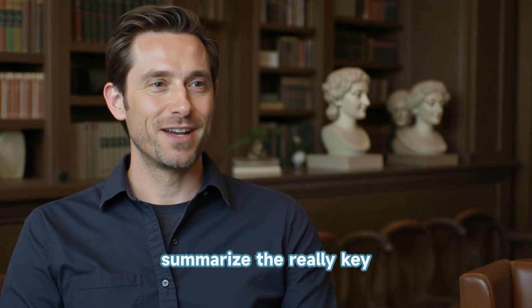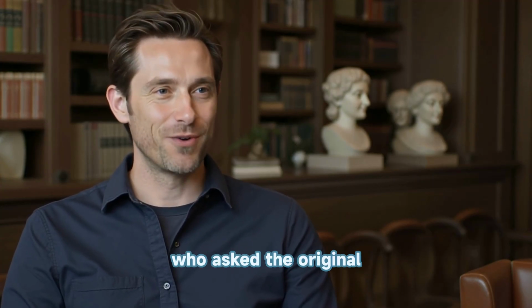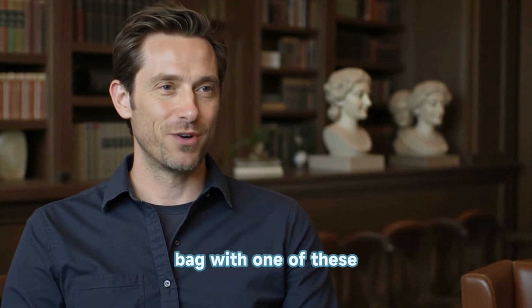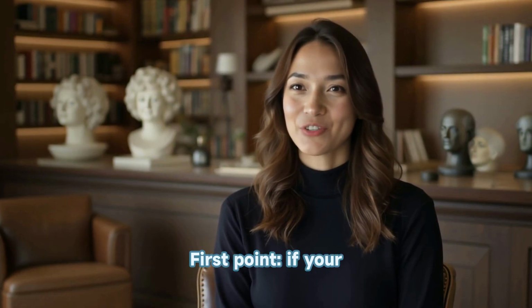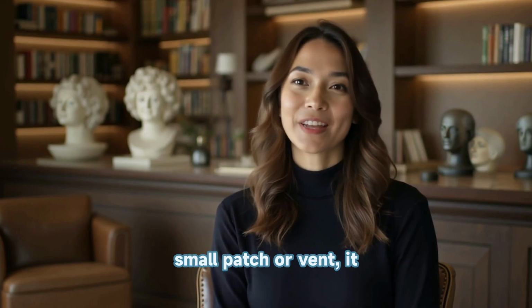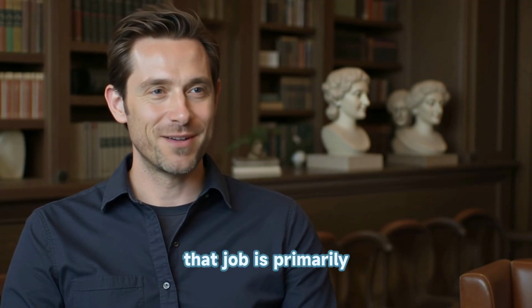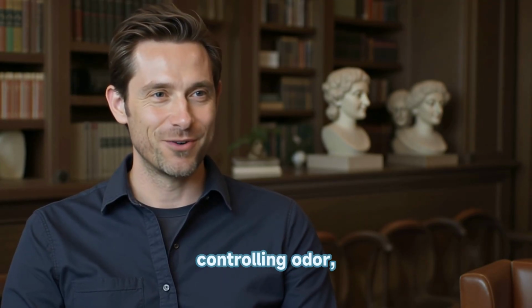Okay, so let's try and summarize the really key points for our listener who has the original question and anyone else listening who uses a bag with one of these filters. Right. First point. If your bag has a filter, usually looks like a small patch or vent, it is meant to be there. It has a job to do. And that job is primarily managing gas buildup and controlling odor discreetly.